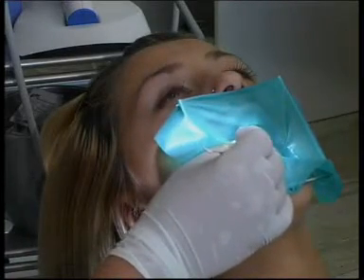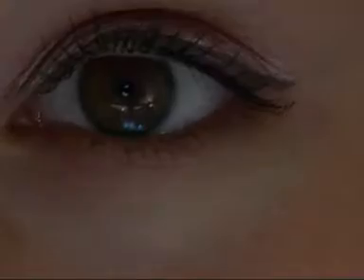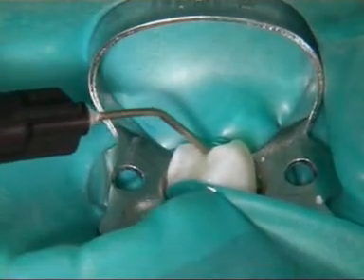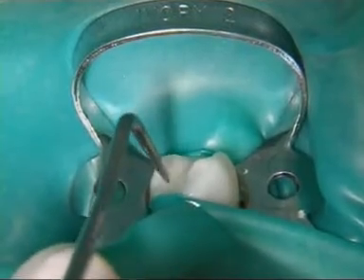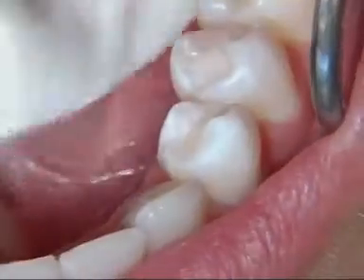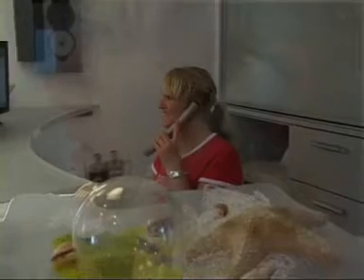Now apply the bond, blow a short blast of air onto it and cure under the polymerization light. The composite is now applied with a fine needle and cured under the polymerization light for 40 seconds. Then check occlusion. The seal should be checked up on at regular intervals by means of patient recall.